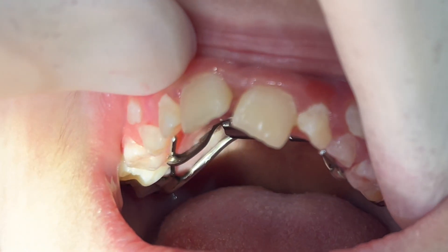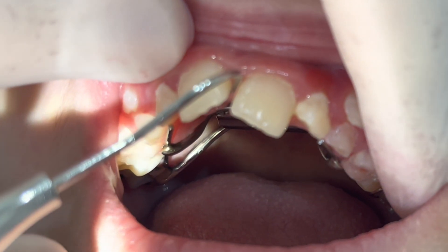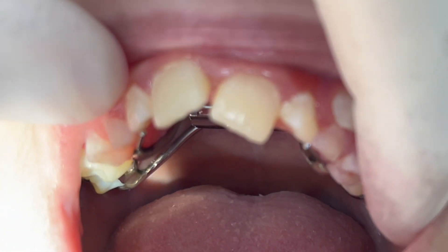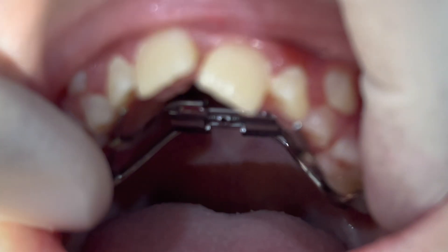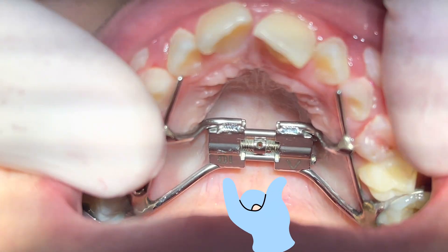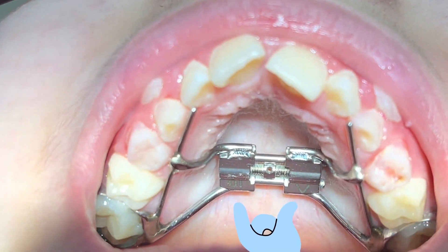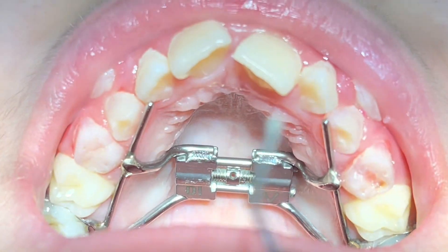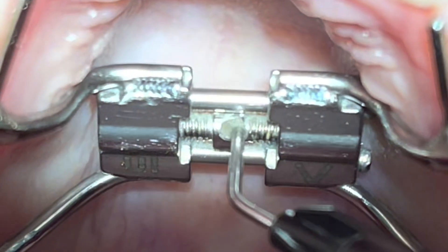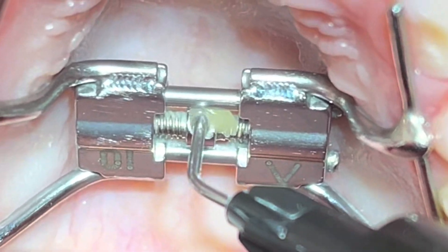As you can see, this gap is around one millimeter in this patient — usually it's more, but this patient had overlapping in the other area so the gap is less. We can also notice the increased distance between the two sides of the Hyrax, meaning we did well with the expansion.